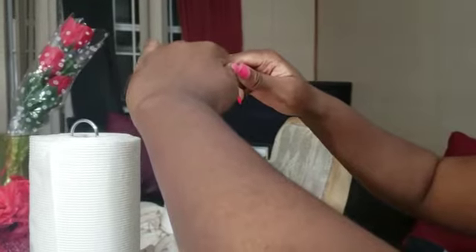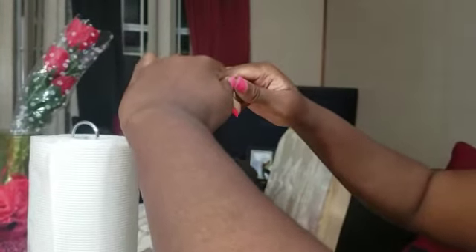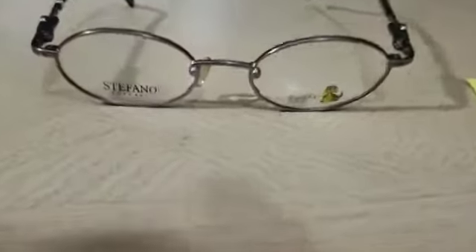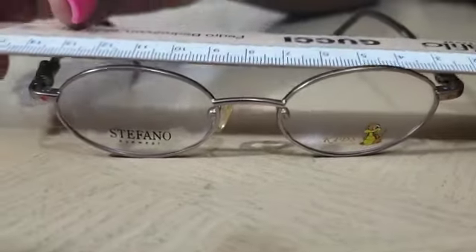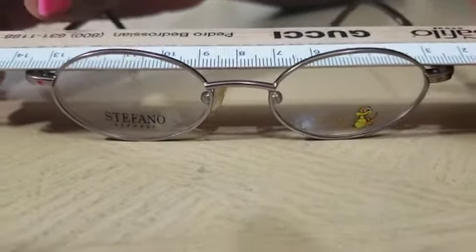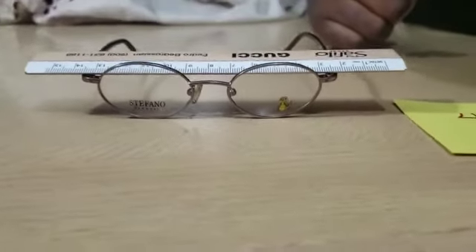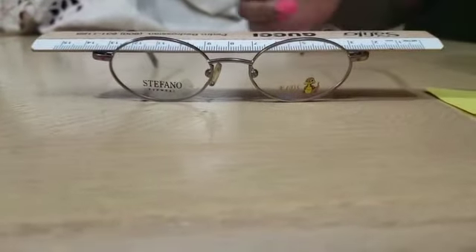We're moving inwards. We place the frame down so that we can check it, take our ruler and place it, and now we can see that it's touching at all four points.